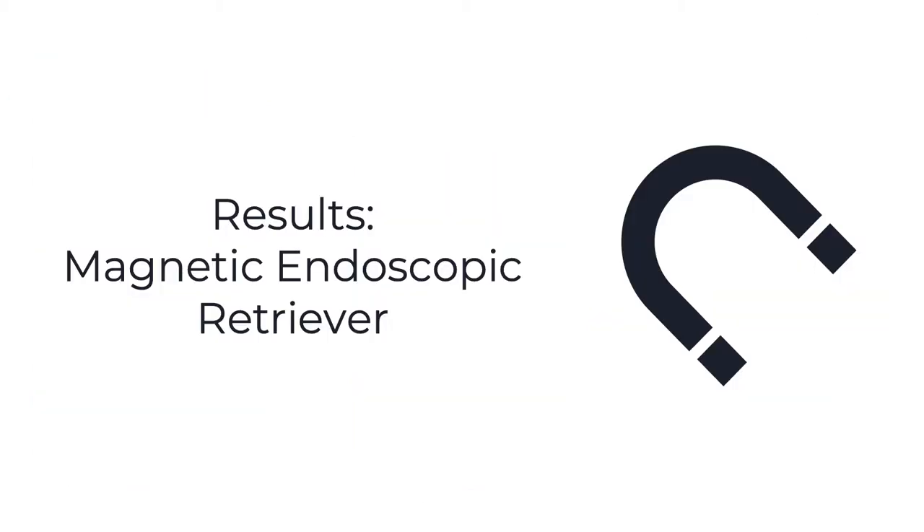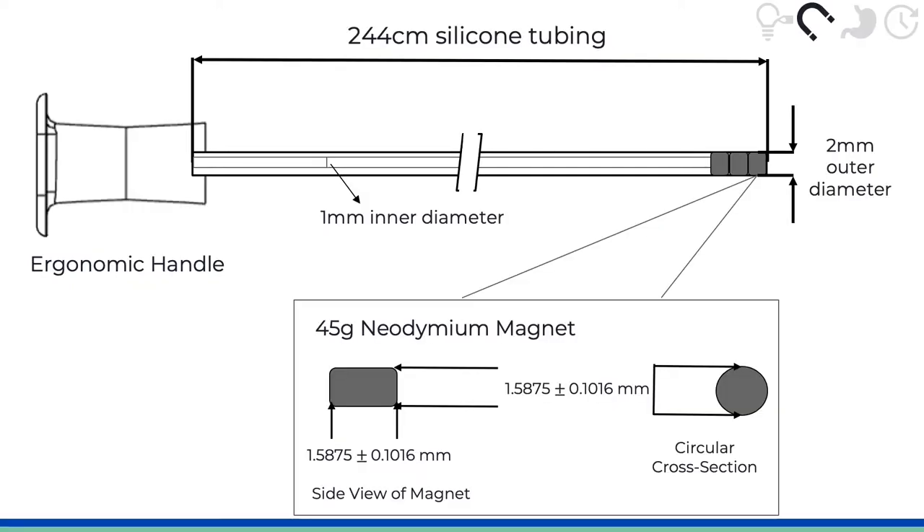Now we will go into the results for Endomagno. Here you can see the final design of Endomagno, which fulfills all of the specifications that we recently reviewed. As you can see, it has an ergonomic handle, a long tube, and three 45 gram permanent neodymium magnets which total 135 grams worth of pull force. This allows our device to interface with endoscopes currently used by physicians.